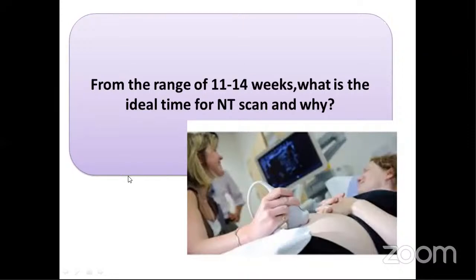That is one. Another such marker is the ductus venosus. It may be reversed at 11 weeks, but normalized by 12. Thirdly, you cannot assess the structure of the fetus properly at 11 weeks as you can later. So at 11 weeks, these are the disadvantages. But at 13 weeks, the only advantage is that the structure is very beautifully delineated. Unfortunately, we call them term NTs. We really hate to scan women when they come at 13 weeks and 5 days and at a CRL of 80 to 82 millimeters because they never pose for a good NT and NB.